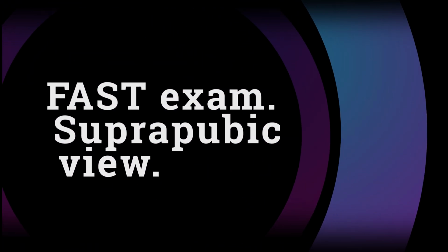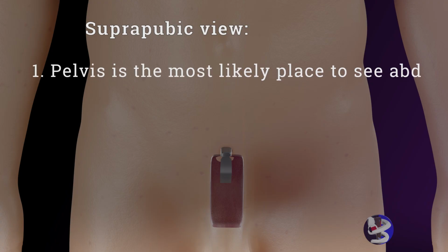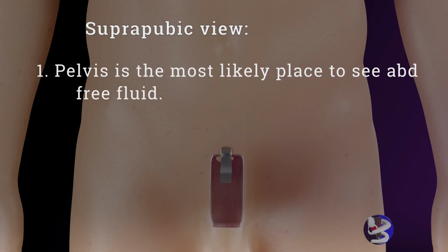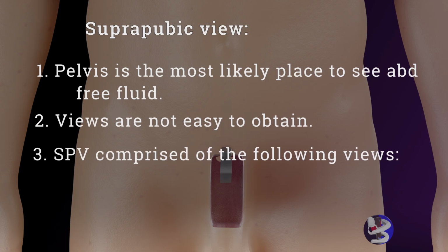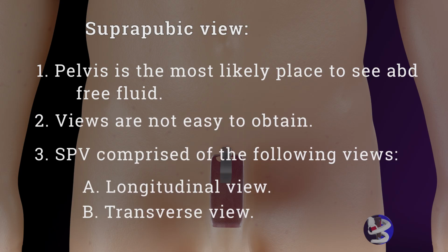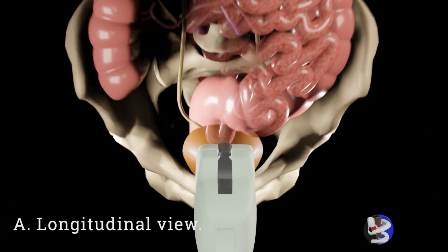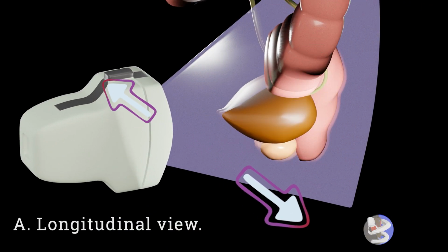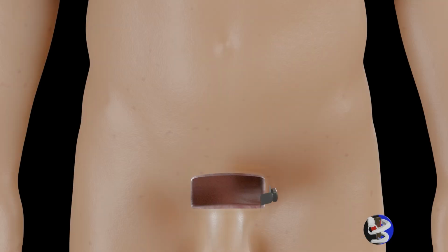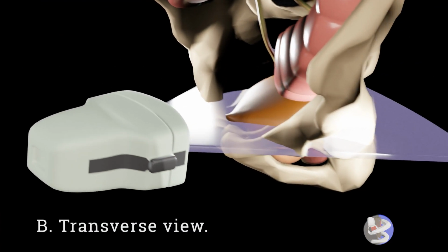Suprapubic view. The pelvis is the most dependent part of the peritoneal space, and it is the most likely place to see abdominal free fluid. However, views are not easy to obtain. There are two planes in this view. The transducer is placed in the midline above the pubic symphysis in a sagittal plane with the indicator pointed cephalad. This is the longitudinal view of the bladder. It is then swept side to side. The second plane is one that is obtained after the probe is rotated transversely and corresponds to the transverse view.